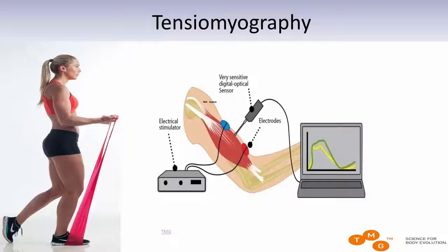What you do is you position a subject that you want to measure on the massage bench in most cases. So like I said, we are measuring muscle function, but we don't require voluntary involvement of the subject. We are not measuring what a certain subject is doing at a certain time. So we are not measuring the subject when they're running or jumping. The other methods can cover that. What we are measuring is the quality of the muscle. So what's the potential of the muscle that we are measuring.